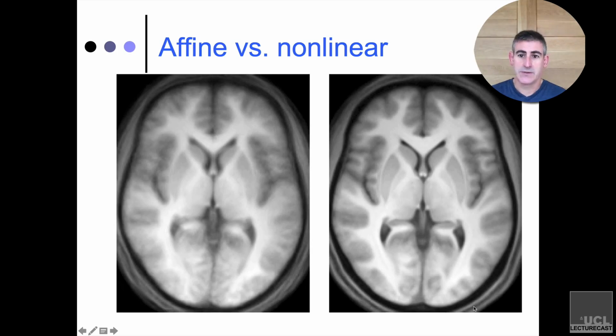What I should say, and be very clear about here, is that I wrote a paper with Russ Poldrack years ago arguing that this is not a sensible thing to do. My opinion is very much a minority opinion. The vast majority of the field think that nonlinear registration for normal healthy brains is definitely the right way to go. I disagree with that, and I'm just acknowledging that you're getting a non-standard perspective here. There's a paper that Russ and I wrote called In Praise of Tedious Anatomy, and we try to make the arguments really clear there.